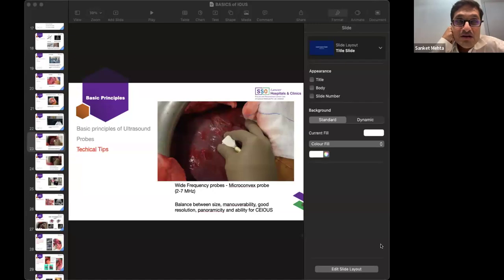We will also learn about how to go about calculating the FLR using the Synapse 3D software. I think the best job is done by the surgeon rather than a radiologist. And I think the whole concept of referring a patient to a radiologist for calculation of FLR is flawed. And we will see why that is the case with real examples. This will be in the third lecture.